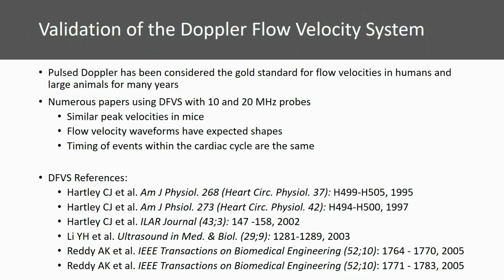Most of you probably know that Doppler has been applied to measure flow velocities about 6 decades ago, and it's considered a gold standard. It's been prevalent, used in humans and large animals for many years now.